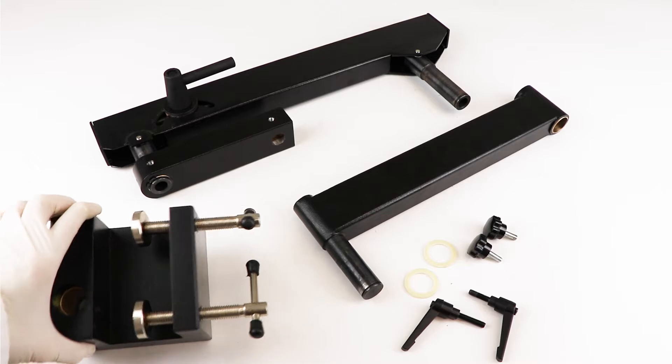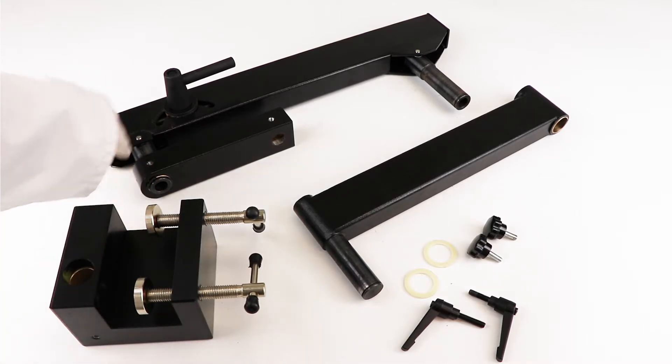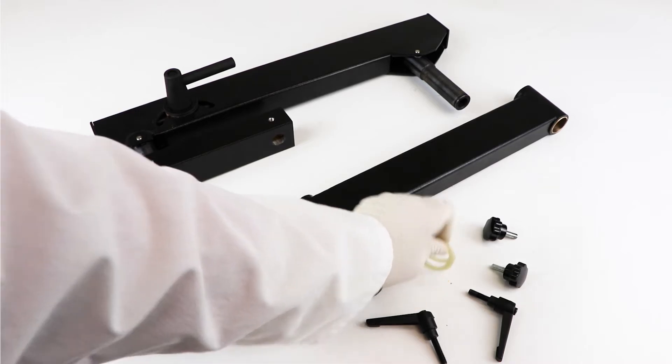These are the pieces of the stand: one table clamp base, an adjustable forearm, a middle horizontal bar, two clutch handles, two adjustment screws, and two ring washers that are white.